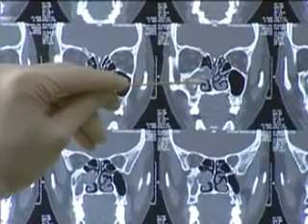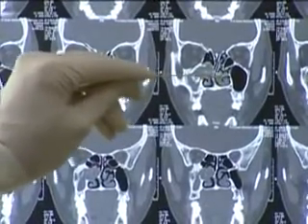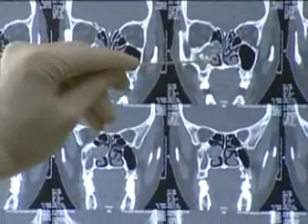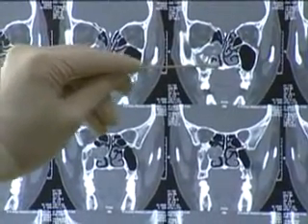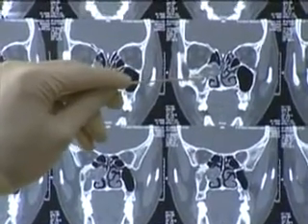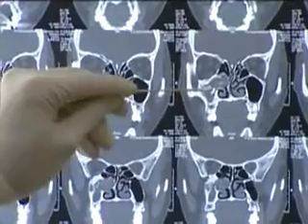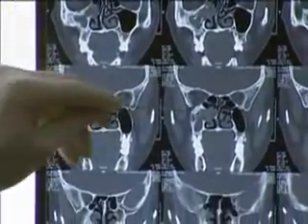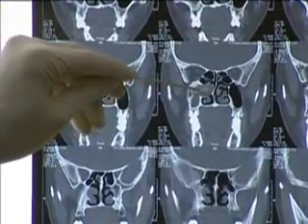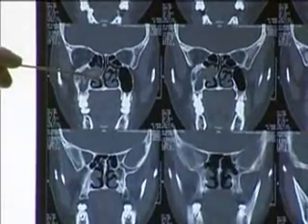The approach that I would take may be, first of all, through the middle meatus. If I can't take it all out, inferior meatus by meatal approach. If still I have problem, I may have to go through the canine fossa, do a sinoscopy through it. The nasal septum is deviated, as you can see here. We have a sharp spur here that I may have to take down. Otherwise, it's relatively straight.